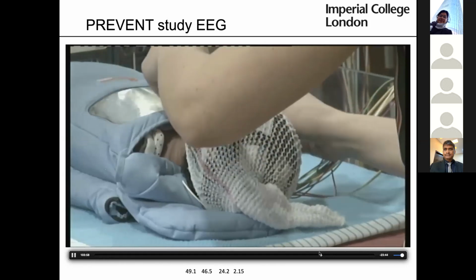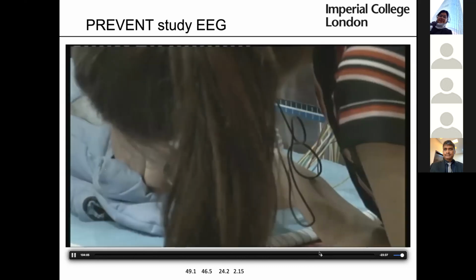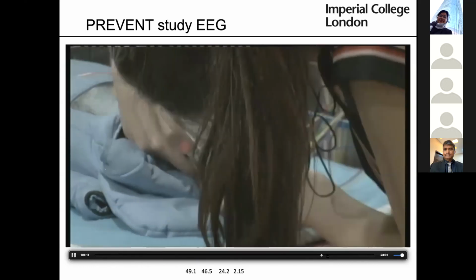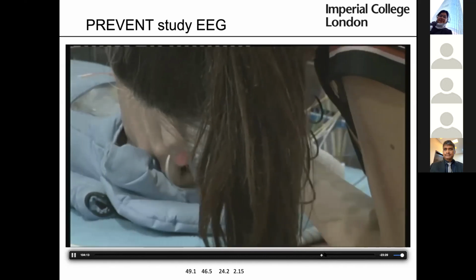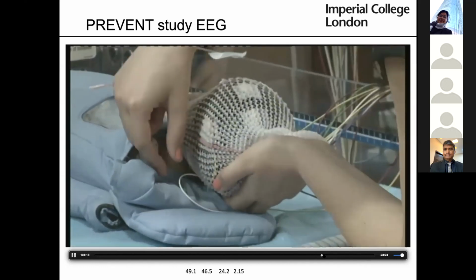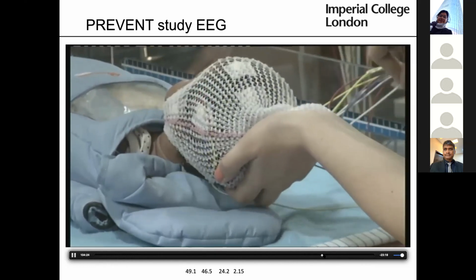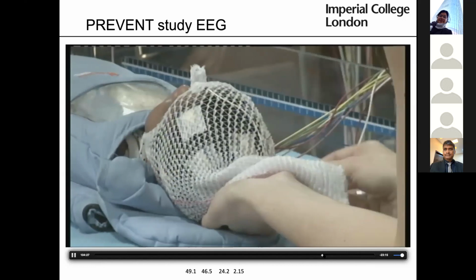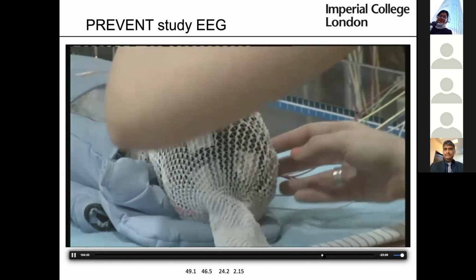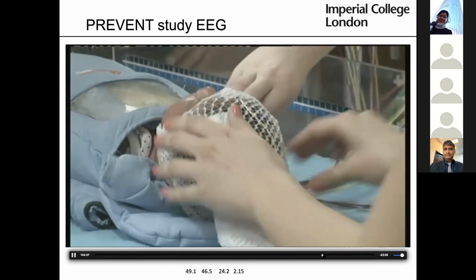There we go. And then again, do a visual check. You can lift the baby's head yourself now, and just make sure the hat is going right down to the neck. And this wire, as you can see, is kind of hanging there, so you can find it and just pull it, and it'll make it easier. There's no loops. And then when you show your hat is okay, these little things make a big difference when you are connecting EEG for a long time.